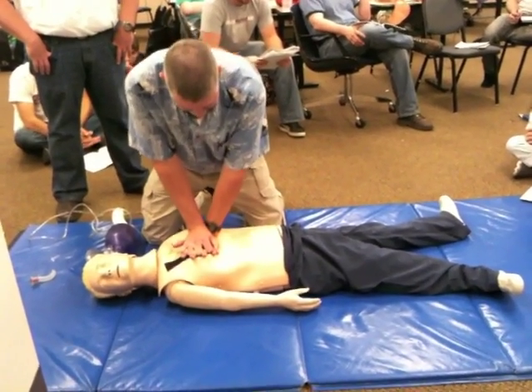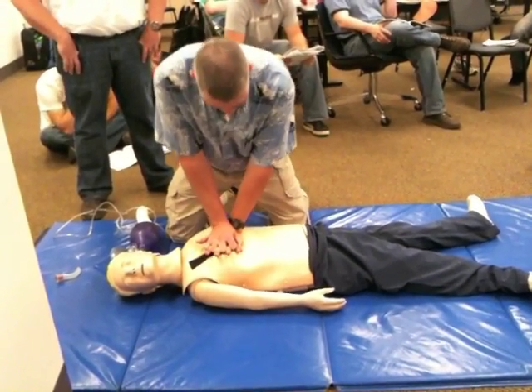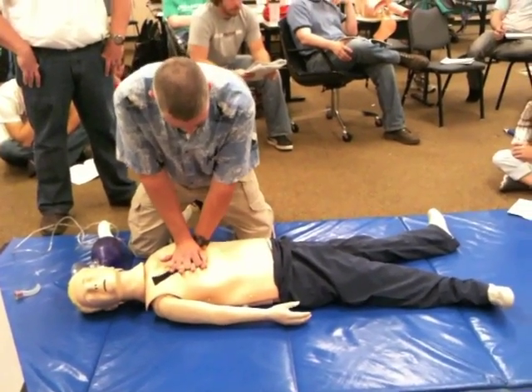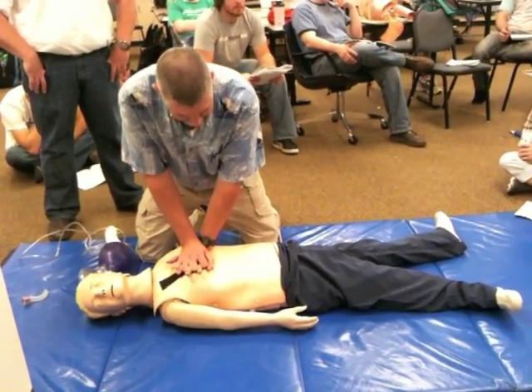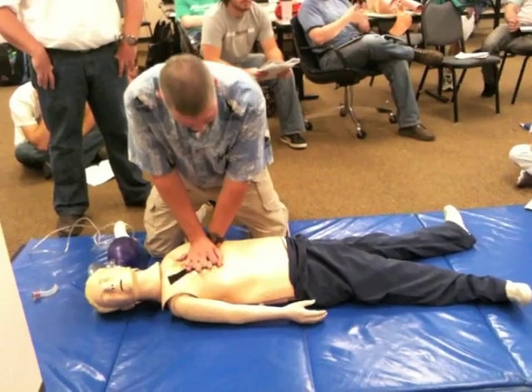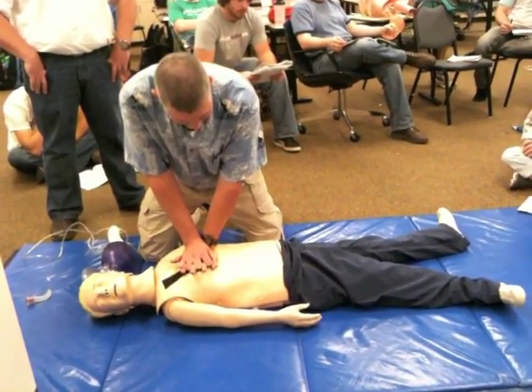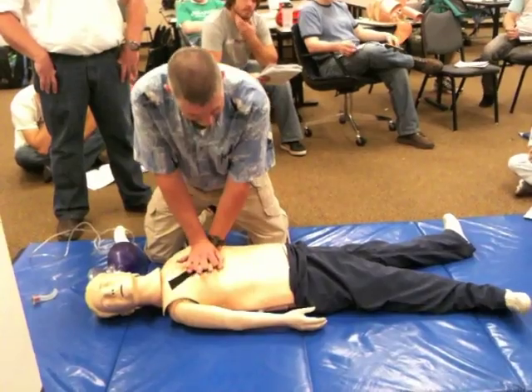My partners and I have BSI. Number of patients is one, with a first responder who may be a secondary patient, family member, or someone who could answer questions. MOI/NOI — no mechanism of injury requiring C-spine precautions. Nature of illness: I see this as a cardiac patient in cardiac arrest. General impression is high-priority medical — a load and go. We'll come in with gloved hands.